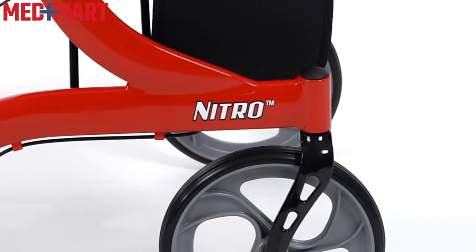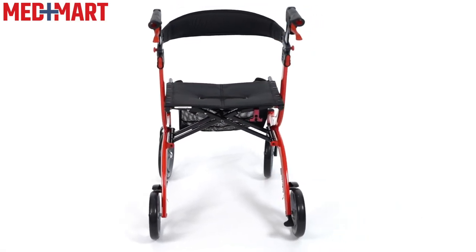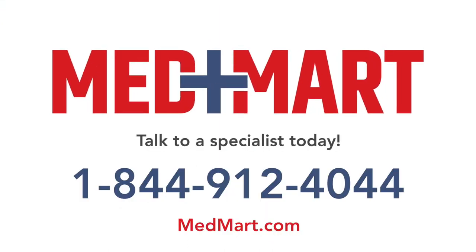The Drive Nitro Euro Rollator is a lightweight, stylish option, and it ships to you assembled right out of the box, ready to go. If you have any questions about this rollator or any of the other products we have here at MedMart, our product navigators are standing by and ready to help answer your questions. Give them a call or continue to browse our website at MedMart.com.